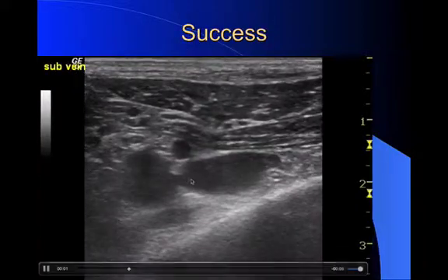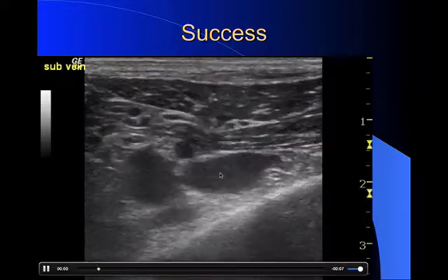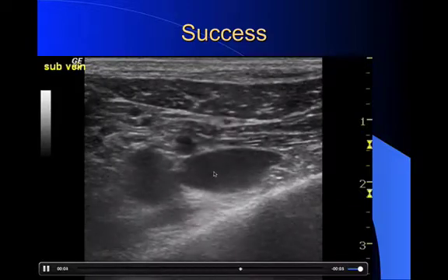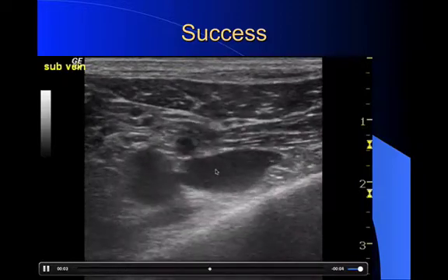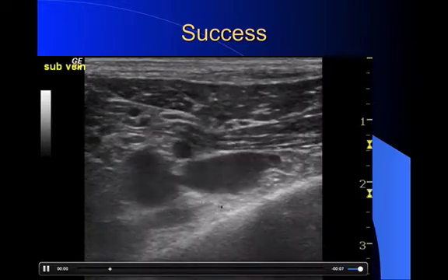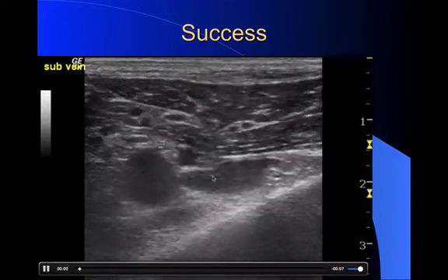This is an example of cannulation, and you have to watch this closely. You see that we are directly above the vein here, and you see that flash of light as the vein is cannulated. That's a reverberation right there, and that means that the vein was cannulated successfully. You can also notice that the posterior wall of the vein has not moved at all, and you know that you did not puncture the pleura in this way.